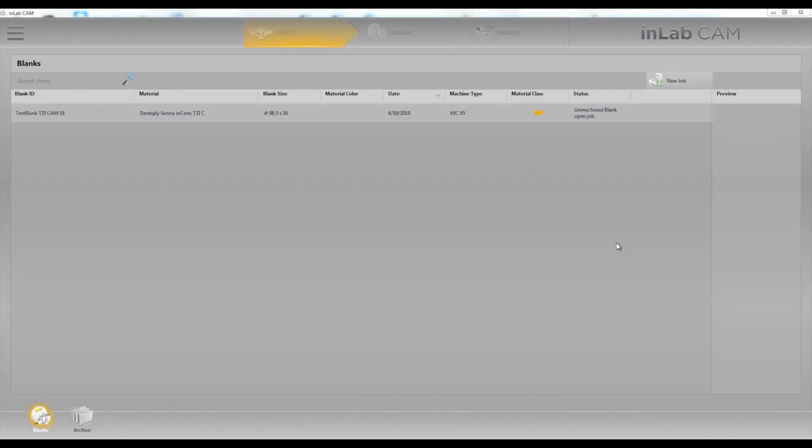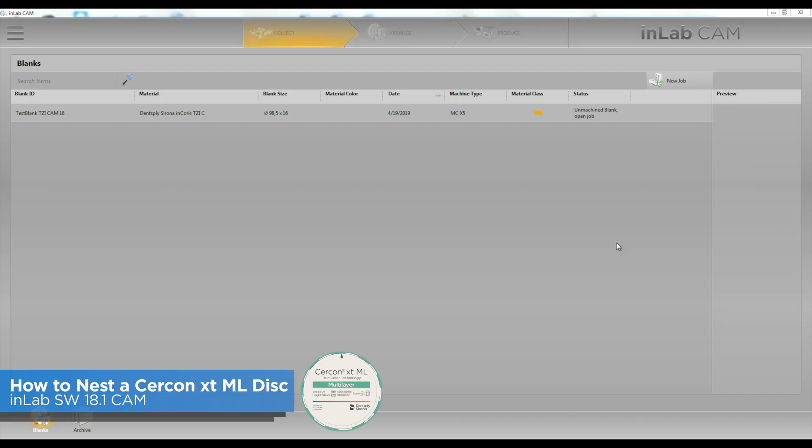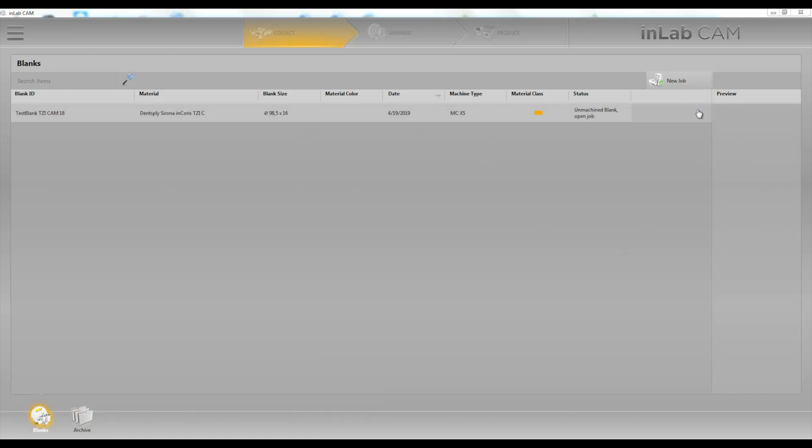Hey everybody, this is Jay Black with Tech in Two. In this video we're going to go over how to nest our zirconia crowns using the Circon XT multi-layer discs. In this video we're going to use version 18.1 CAM software.